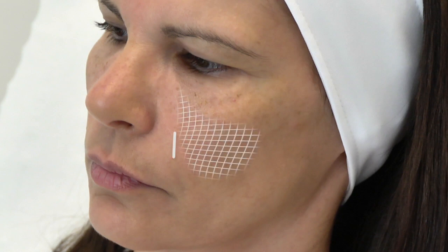Several insertion points are possible for injecting the mid-jugal fold and the associated loss of centrofacial volume. Injections are done throughout the depression area using the fanning technique. The fan extends over the lateral nasal region to the malar eminence while respecting the lower limit of the eye ring. Several fans can be combined. Injections can also be made using adjacent bolus techniques, the pillar technique, when volume loss requires greater projection.